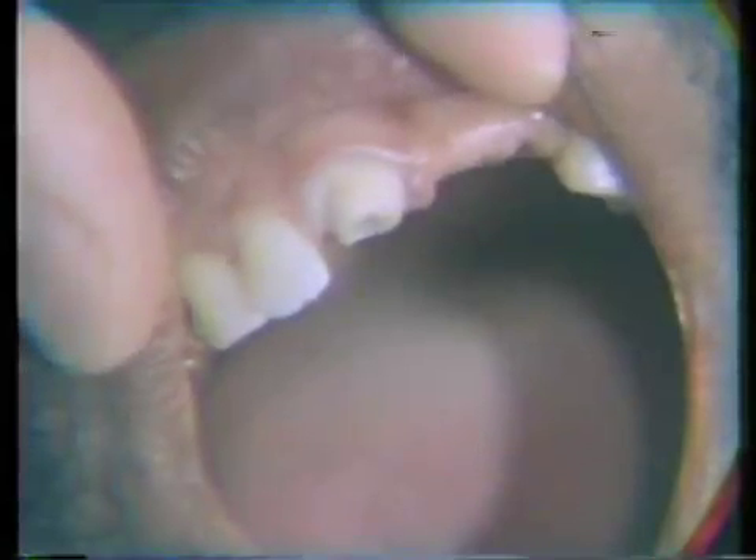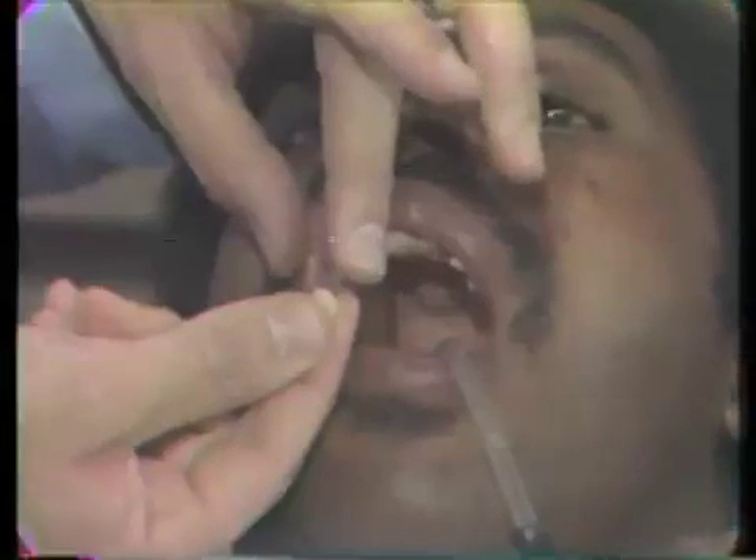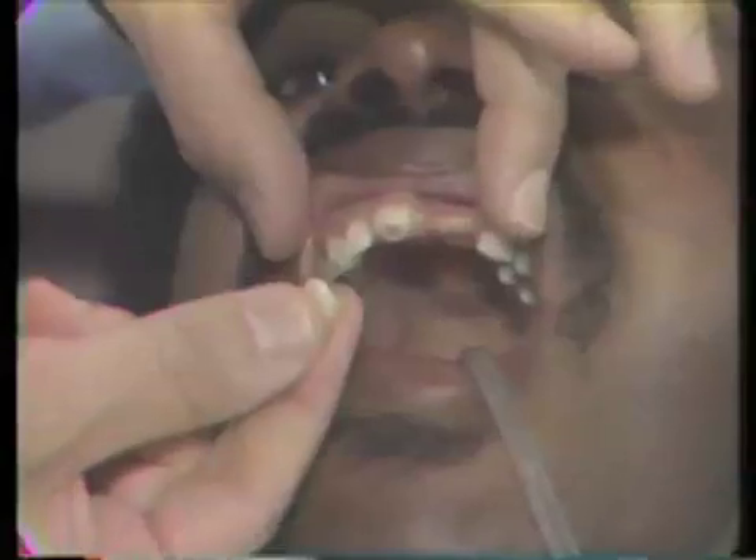The next step is to fabricate a temporary crown, which we have already done. The temporary crown is fabricated with a large paper clip cut off that fits into a polycarbonate crown. This is then lined with Duralay and makes a very nice temporary. This will be cemented in with a temporary cement.